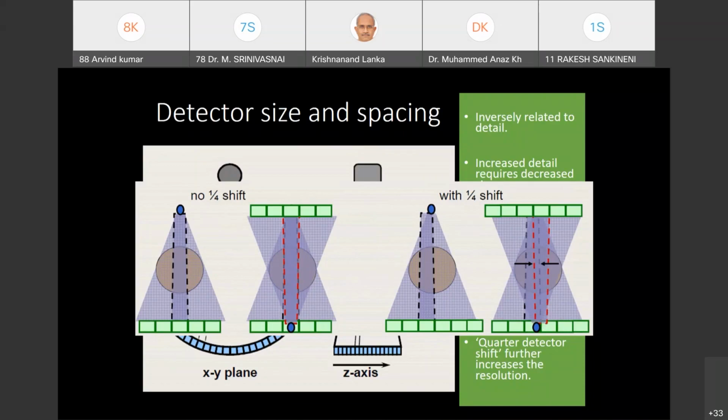In fact, these are some of the strategies people use while taking a CT scan. How much overlap is used may vary. Myself and Ravi Kumar, we did some kind of error compensation strategies for imaging. There, with Manmadachari, we came up with some strategies to improve the resolution.